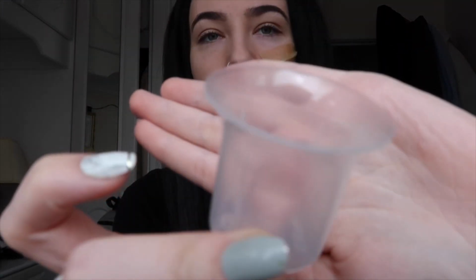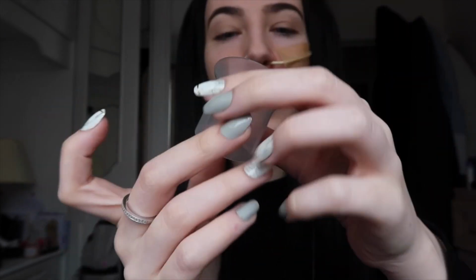Okay guys, so what you are going to need before you do anything, if you are feeding with the NG, you're going to need like a little pot or something that you can drain your tube with. So you're going to need like a little container or something like that, you want to test the acidity of your stomach, because it has to be a certain pH level before you can feed into it. So I've just used like a little pot like this. This is just like, I don't know what these are called, but it's just like a medicine measurer, I guess.